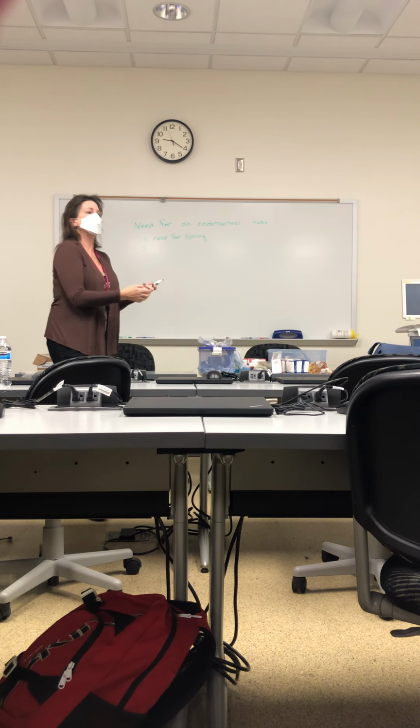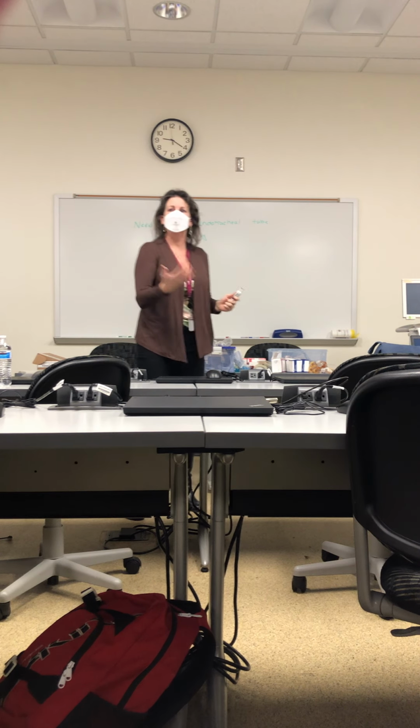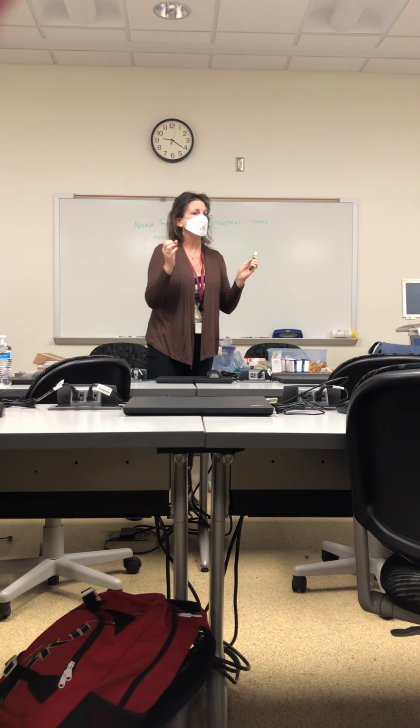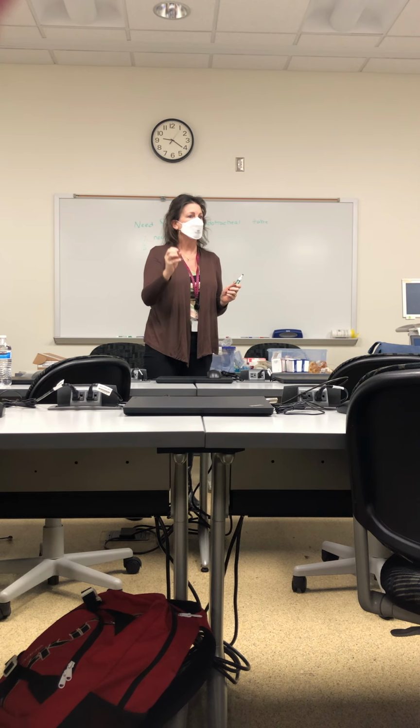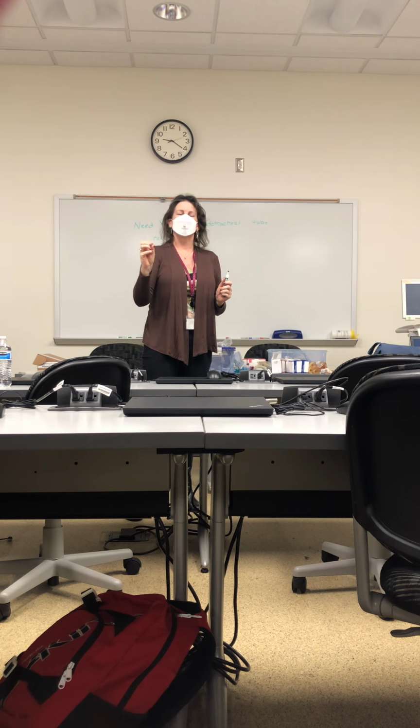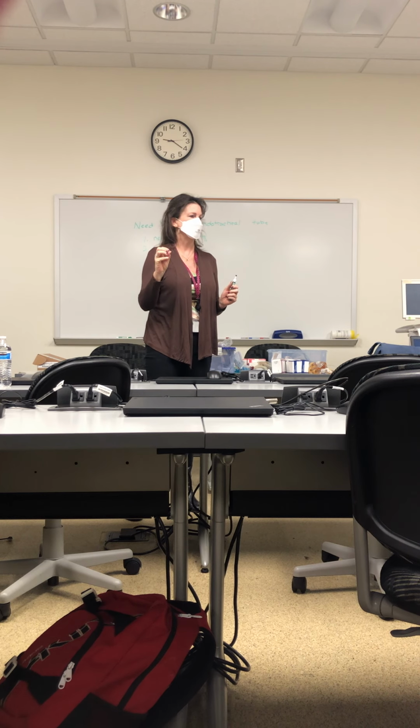So we say, well, we've tried and tried and tried, the patient's deteriorating, we're going to have to intubate just to keep what we call good pulmonary toilet. Have you heard me say that before? Pulmonary toilet is an English term used in the medical field, and it means to keep the airways clean.